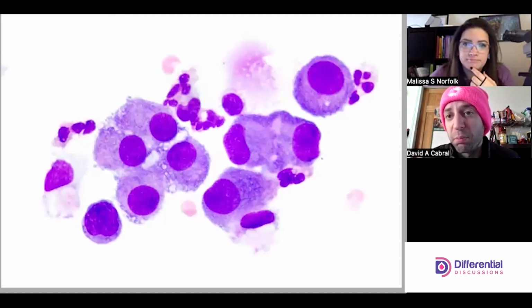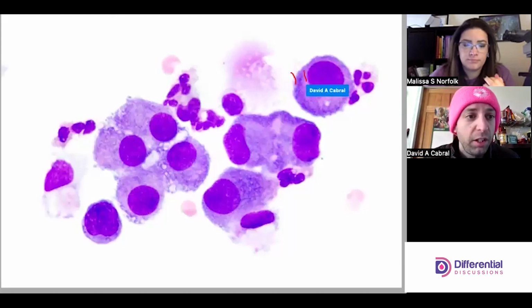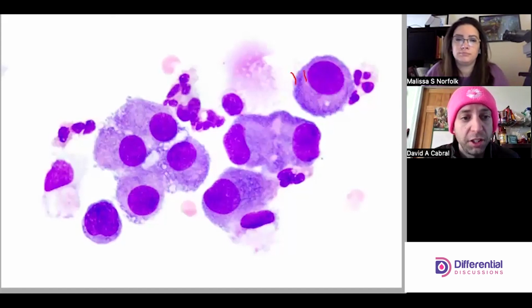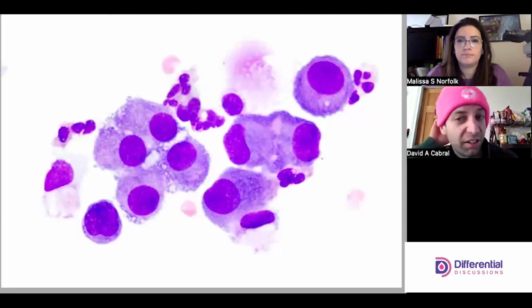The reason I don't believe it's a perinuclear halo: someone might point to the differential in color between here and here, and I would acknowledge that there is a differential in color. The problem is a perinuclear halo is never going to go continuously all the way around the nucleus. So that's inconsistent. Knowing what we know, this is more consistent with a fried egg appearance of a mesothelial cell. For many of those reasons, it's not.